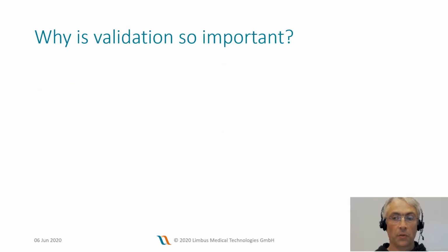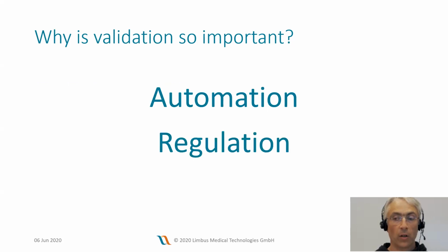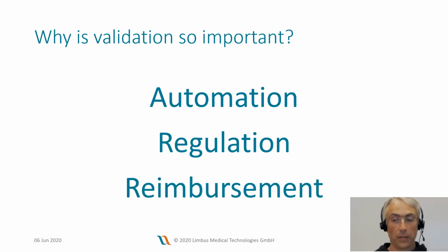You may compare this to the self-driving car. If you ever want to achieve a fully automated process, you must be sure that it works reliably. Without validation, you will never be able to take the hands off the steering wheel. You will have to constantly check and monitor your results, which is just not feasible in the case of whole exomes. If you are performing whole exome sequencing on patients and not just studied subjects, you are required by law to validate your diagnostic process. Last but not least, at least in Germany, genetic tests may only be reimbursed if they have been validated.